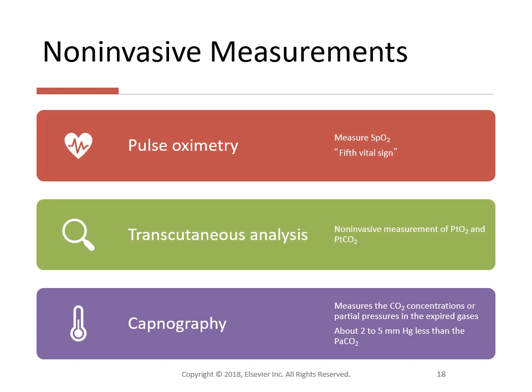As a non-invasive substitute for PaCO2 to assess ventilation, we generally use the end tidal partial pressure of CO2, or PETCO2, although percentage of CO2 can also be used. Normally, the PETCO2 is about 2 to 5 millimeters of mercury less than the PaCO2.